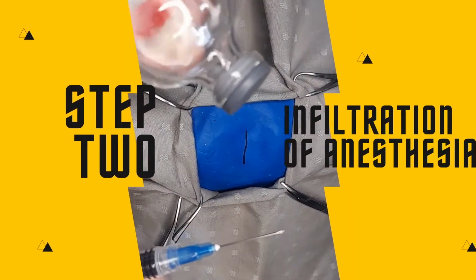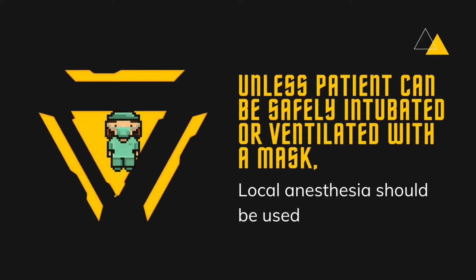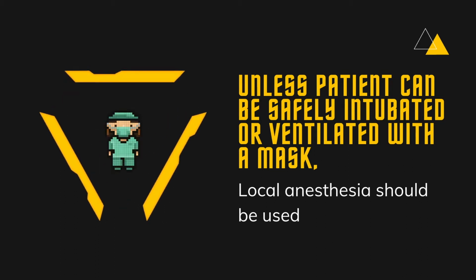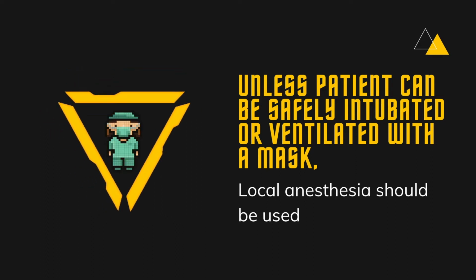Step 2. Infiltration of anesthesia. Unless the patient can safely be intubated or the patient can be ventilated with a mask, a tracheostomy should be done under local anesthesia.